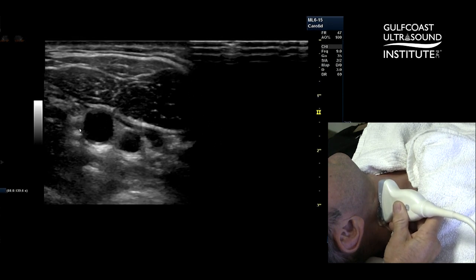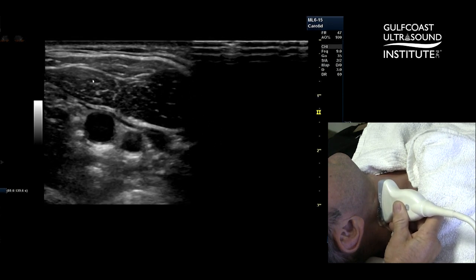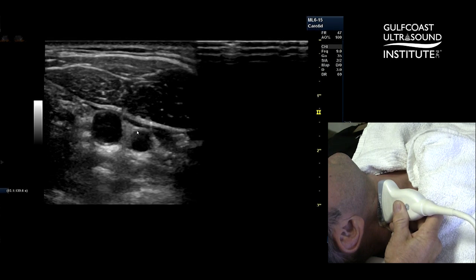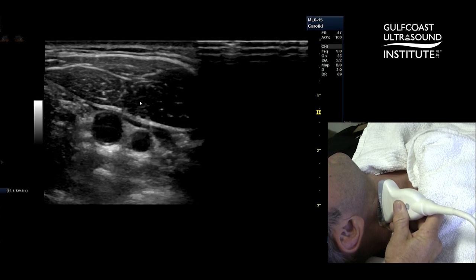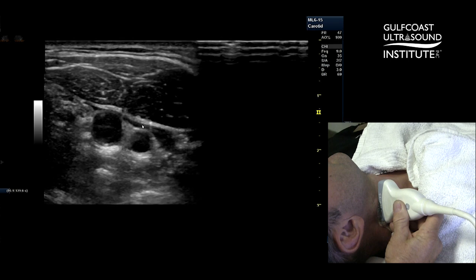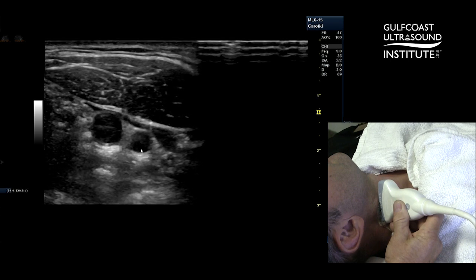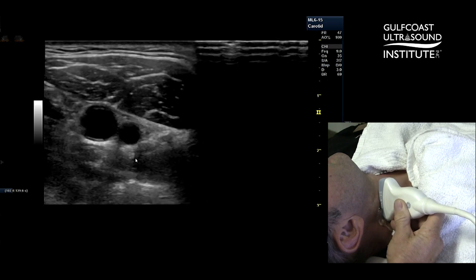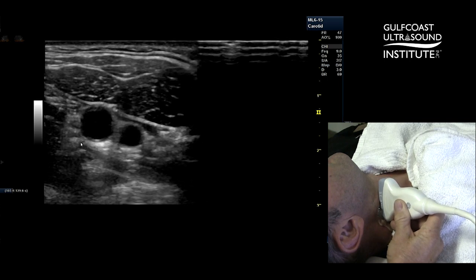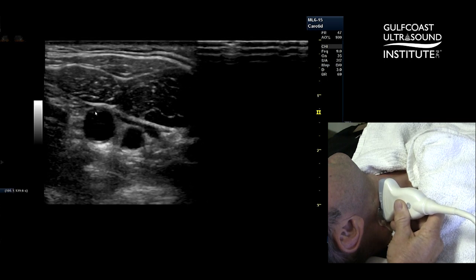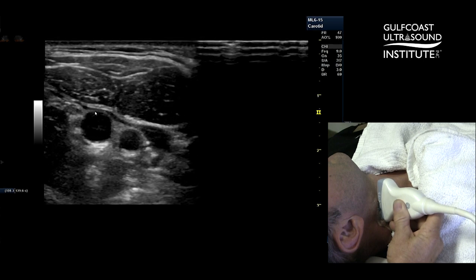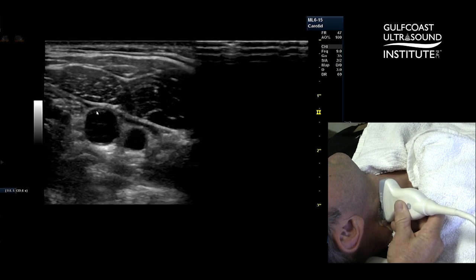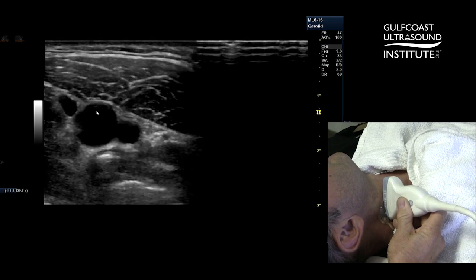The next step is to identify which vessel is in the near field versus the far field. The position of the external carotid can be near field, the same side as the internal carotid, or down deeper in the far field. But here, we know that the internal carotid is posterior. It's also slightly the more superficial one. So when we go to our longitudinal position, we'll expect to see the internal carotid artery in the near field.